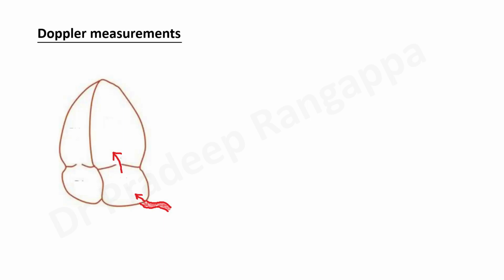The physiology is that when there is diastolic dysfunction, if you recall the previous talk, the LV gets hypertrophied and you need increased LA pressure to empty the blood into the LV, which means there is a backflow into the pulmonary veins and it leads to congestion and pulmonary edema. So that's why we look for the systolic and diastolic reversal in the pulmonary venous flow in diastolic function, which I will talk about.